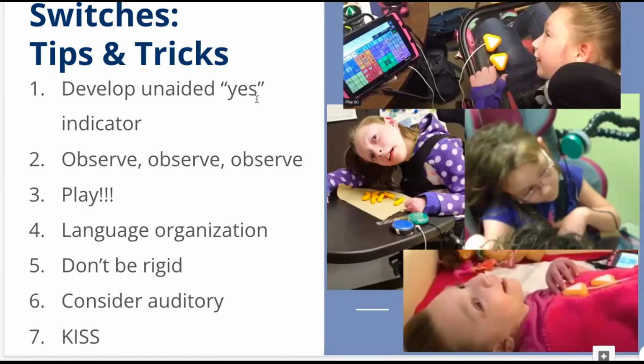So observe those movements, observe the different locations we can be in, and whether they're little or they're adults, play. It's already incredibly challenging work to access switches.